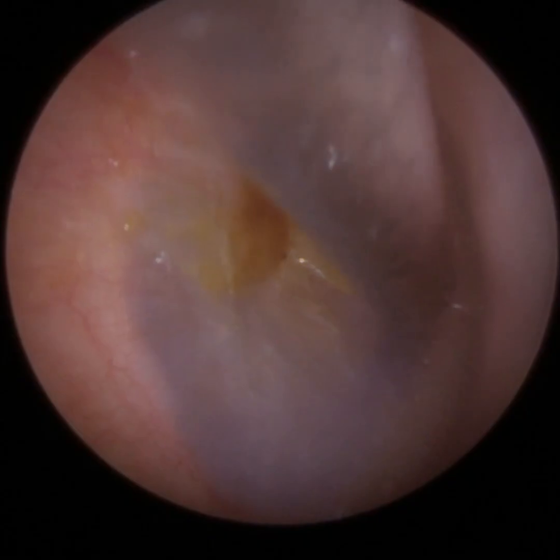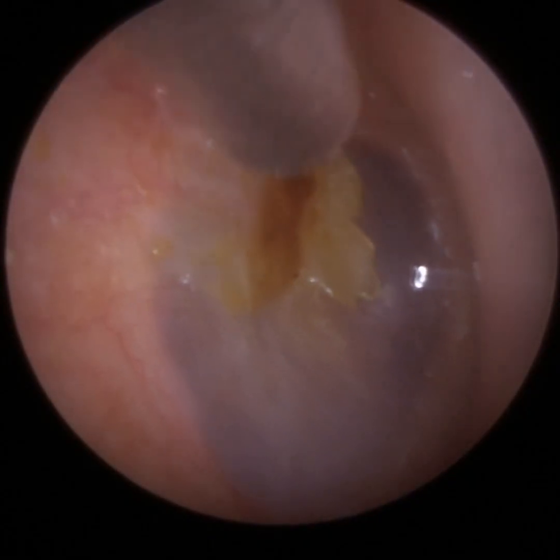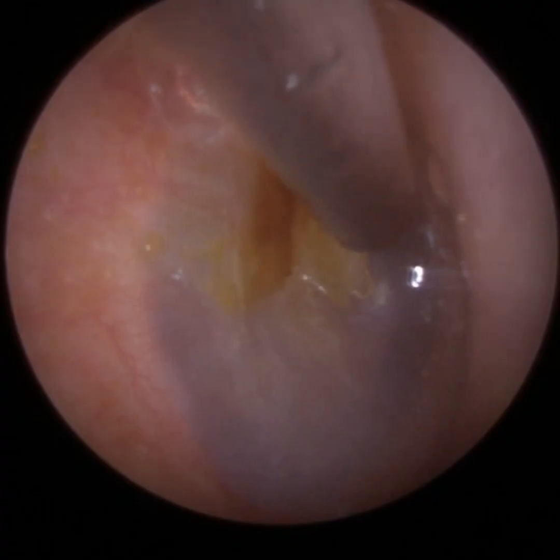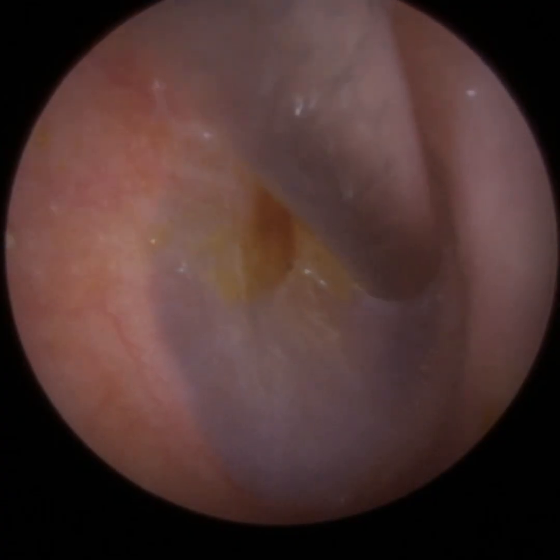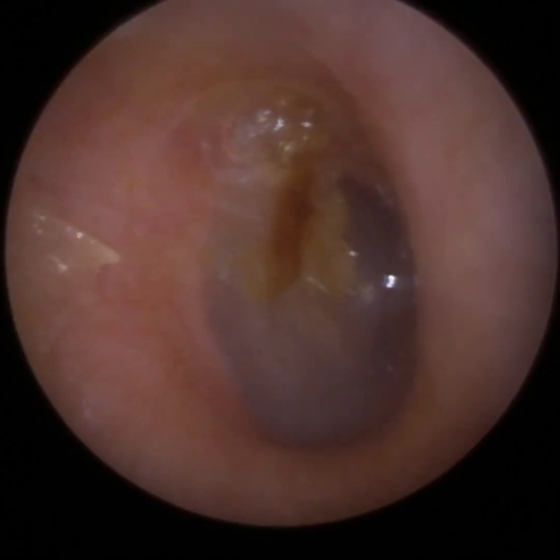So I'm just going in with the suction probe. I just want to drain and suction this excess sodium bicarbonate drops. And we're in the anterior recess. You can just see that view, how amazing it is, and how we can get access there. And I'm just hovering it.